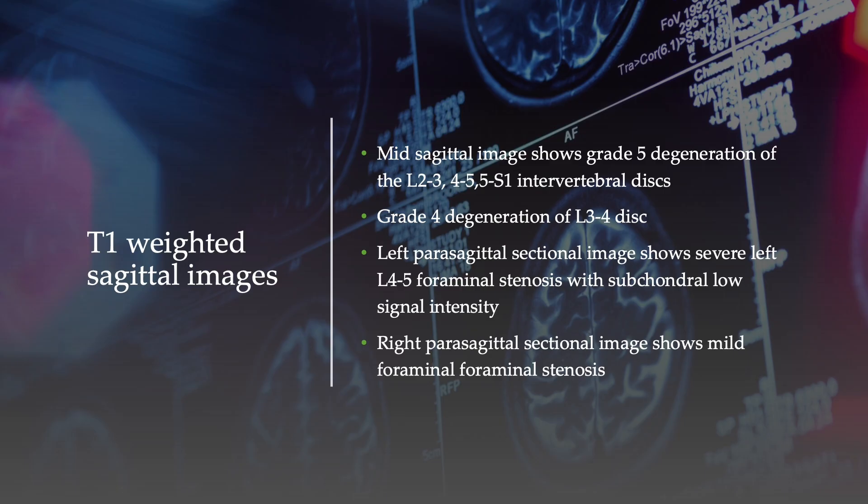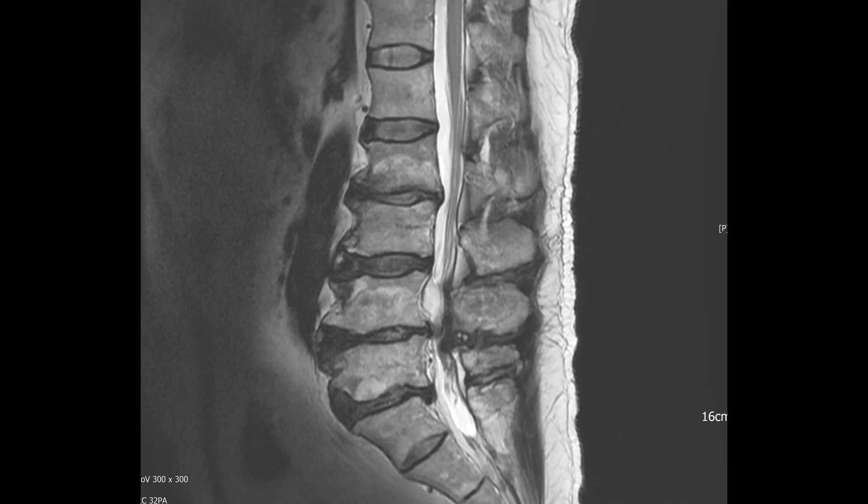T1-weighted sagittal images reveal significant findings. The mid-sagittal image displays advanced degeneration — grade 5 — at the L2-3, L4-5, and L5-S1 intervertebral discs, with grade 4 degeneration noted at the L3-4 disc.